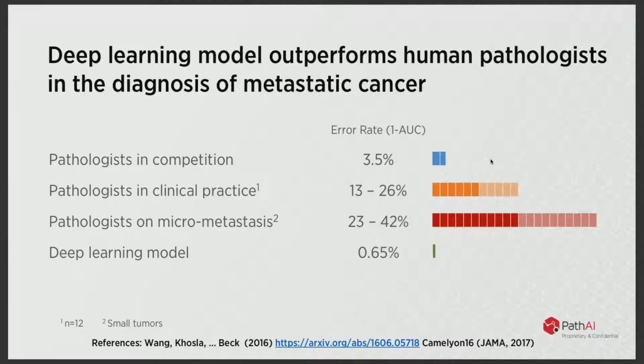And this, I think, isn't in the reference I sent. The one I sent showed how you were able to combine the estimates of the deep learning system with the human pathologist estimate to make the human pathologist error rate go down by about 85% and get to less than 1%. And the interesting thing is how these systems keep getting better over time, and potentially they overfit to the competition data set, because I think we submitted it maybe 3 times, which isn't that many. But over the course of about 6 months after the first closing of the competition, people kept competing and making systems better.